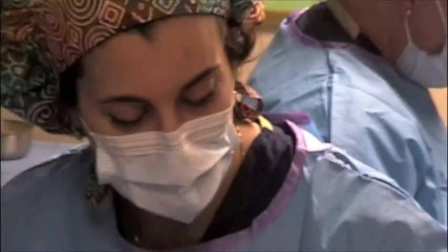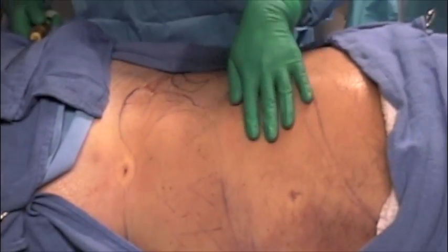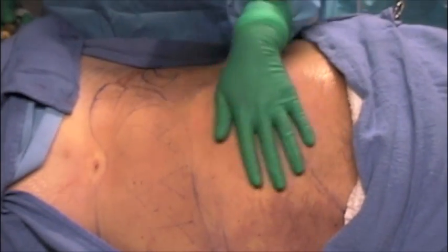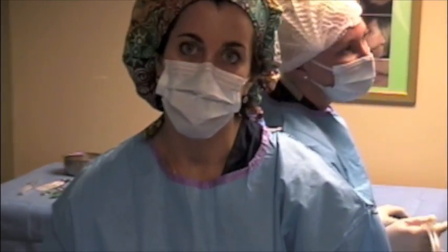Finished taking fat out of this area. You can see how thin the skin is, and this is his end result. It's already apparent. The skin is not distended. You can see how flat it is. Now I'm going to finish the lower back, but I wanted to harvest all the fat from this region, and now I'll finish contouring the back. The entire procedure took about 30 minutes.